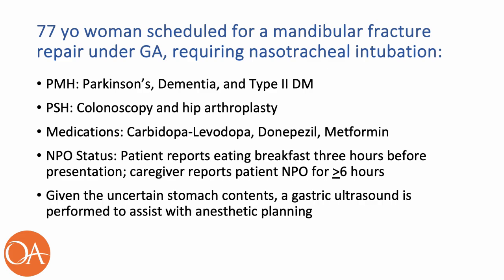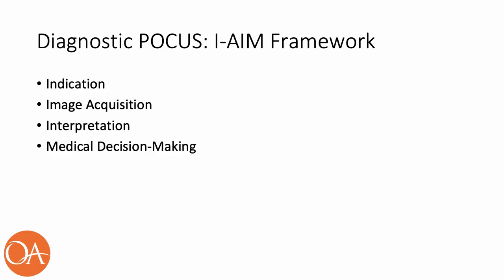Regarding her NPO status, the patient reports consuming breakfast 3 hours before presentation. However, her caregiver reports that she has been NPO for over 6 hours. Due to this discrepancy and the uncertainty about the contents of her stomach, a gastric ultrasound is performed to assist with anesthetic planning. To organize our discussion of the gastric ultrasound exam, we have been using the IAIM framework: indication, image acquisition, interpretation, and medical decision making.